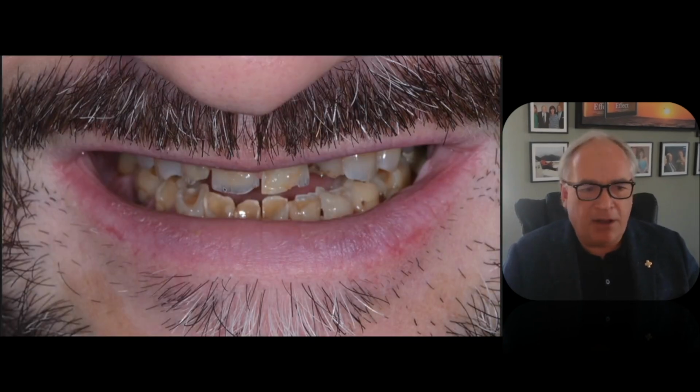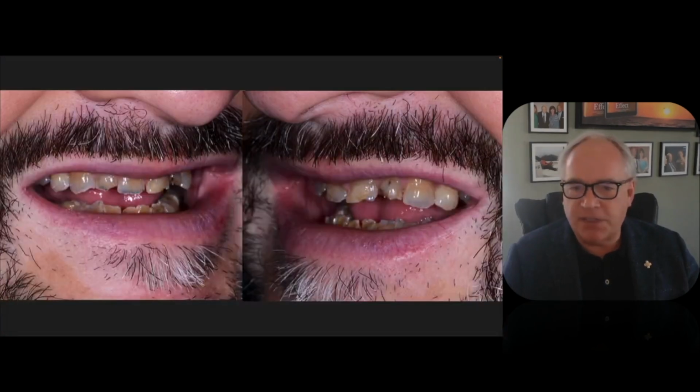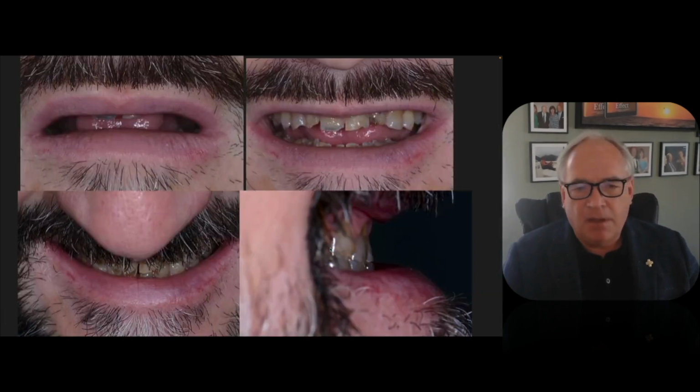And looking at his smile, 3 views, you can definitely see very broken down lower incisors as well as upper incisors, but we can also see fairly good curvature to his lip, and we can look at it and imagine nice teeth being in there. We look at the length of teeth. We start with the rest position, which is this top left picture, and it's showing about 1 millimeter at 9, and we might want to add a millimeter to that. The E position, we should see this edge half the distance between the upper and lower lip.